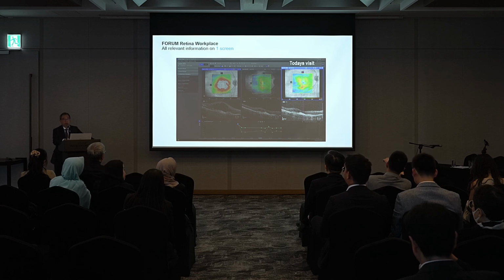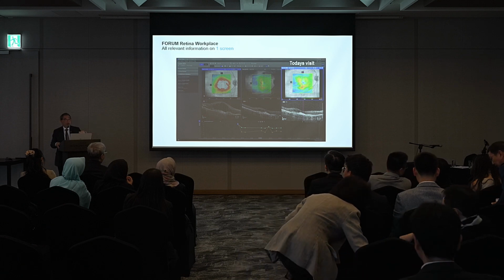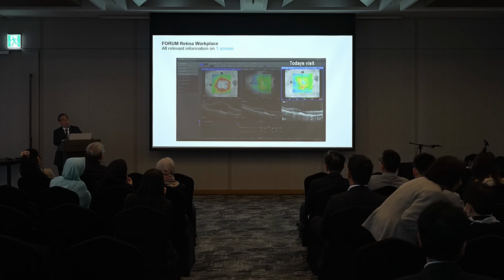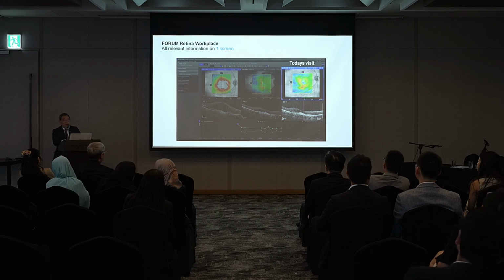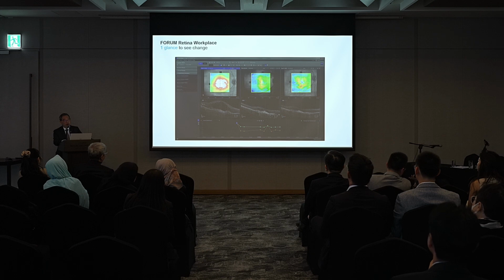Here you have the ability to have 3 visits, usually a first, prior, and today's visit, or you could change whichever visit you prefer. You could set one as a baseline with subsequent comparisons. Right? This is a patient with cystoid macular edema, subsequently followed up at the prior visit, and then the current visit where the macula is almost dry. All on one screen.